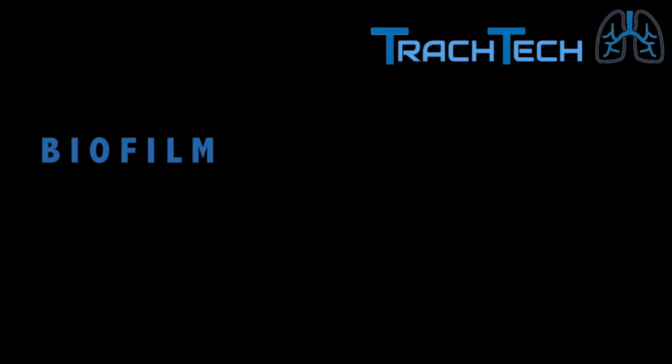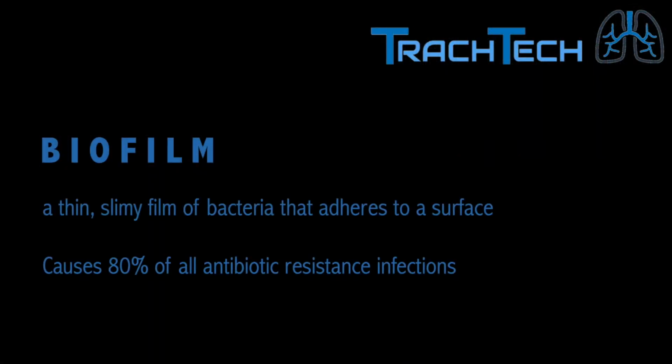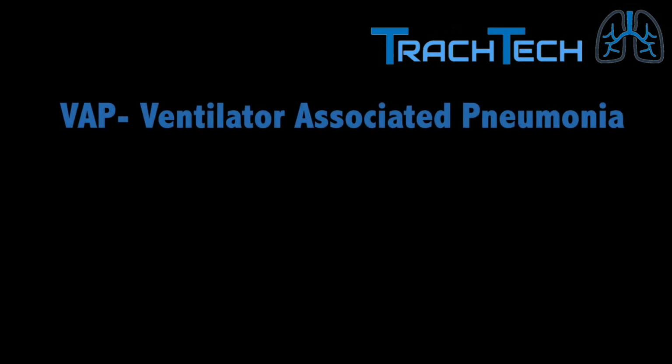Our design concept was inspired by complications that can arise following endotracheal intubation, specifically those cases involving ventilation. Patients that require mechanical ventilation are often intubated with endotracheal tubes, which can experience a buildup of biofilm, which can then have serious implications. This biofilm buildup directly leads to 80% of antibiotic-resistant infections, the most common being VAP, or Ventilator Associated Pneumonia. VAP is a lung infection that develops 48 hours or longer after mechanical ventilation has begun.